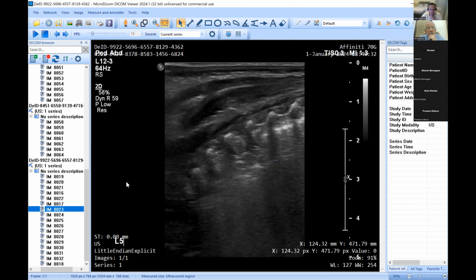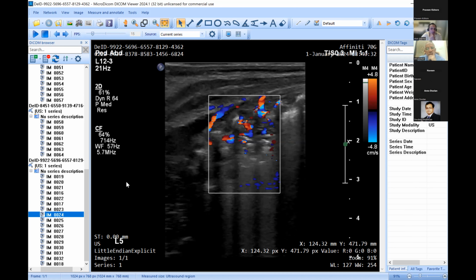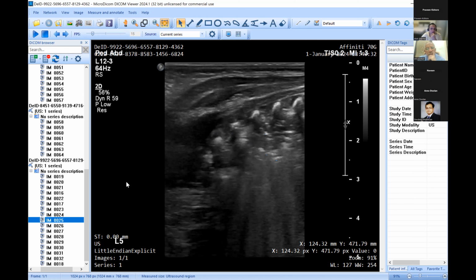So there's definite progress clinically. Other than the feeding side of it, obviously that was going to take a while. But from a respiratory point of view, he was progressing. So this is L5, and that is also L5. The question is whether this is an inspiration and that's an expiration. Because this one looks a little bit worse. So I just wonder whether that's an expiration. Again, very good depth penetration up to 4 centimeters, good gain. The question is whether we can get your probe a little bit more perpendicular in that region.